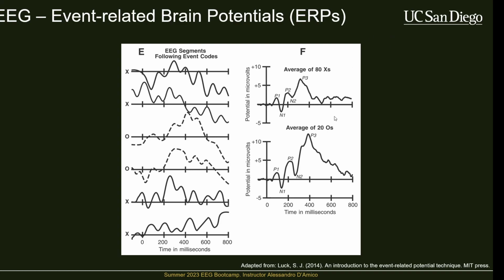The only reason I'm saying that is because there's a lot of researchers that don't really understand this research that well, that will sort of just see peaks or troughs emerging from averages from an experiment, and they get like 500 people or whatever, and they're like, oh, this is a component, and I know because it looks like a component. It's not that simple. It takes a lot of systematic investigation to determine what's actually going on, and is this actually a reliable signature of the brain.